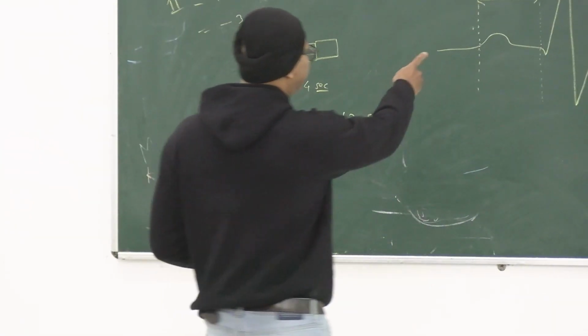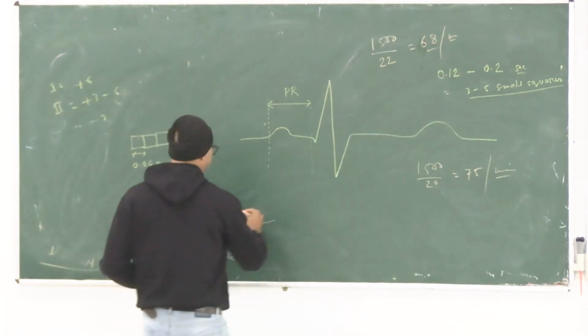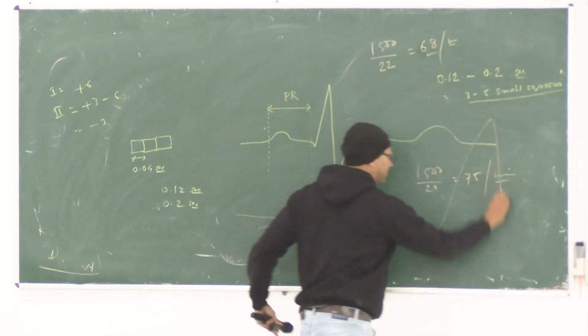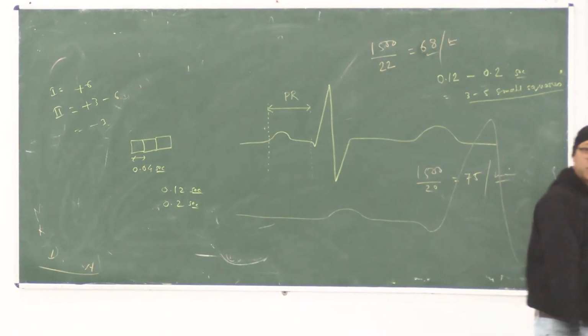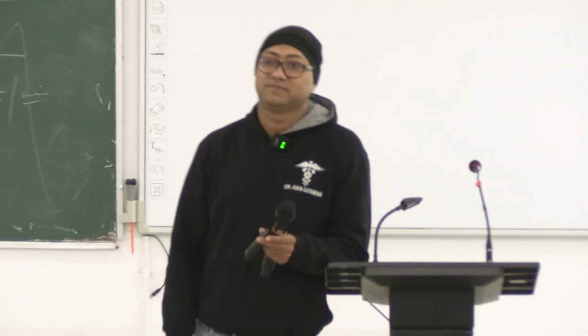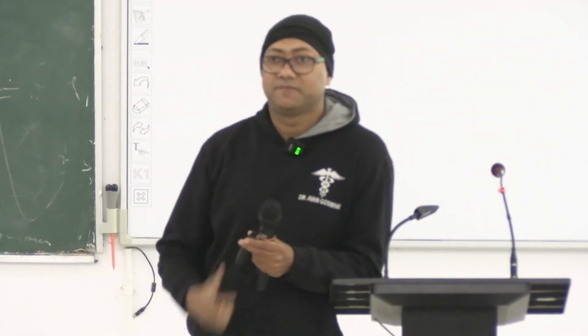So this ECG wave, say this is an ECG complex, right? A single complex. Now it will be, right? So it will be spread out. And if I decrease the speed, then waves will be congested, condensed, right? Okay.